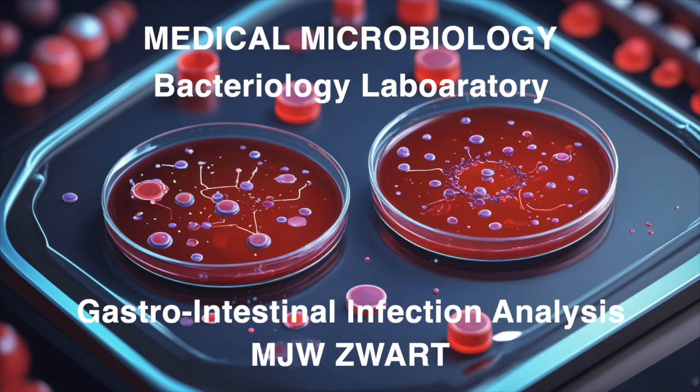Let's say those PCR results come in and it's positive for Campylobacter. What happens then? Well, we need to know exactly which species it is, right? Most likely it'll be Campylobacter jejuni or Campylobacter coli. Got it. And that means remembering how picky these bacteria can be. Time for that bacteria recipe book. Yep. For Campylobacter, we'd use a special media like CCDA agar, and we have to incubate it in a microaerophilic environment. Campylobacter prefers low oxygen. Right. Got to make those little guys comfortable.